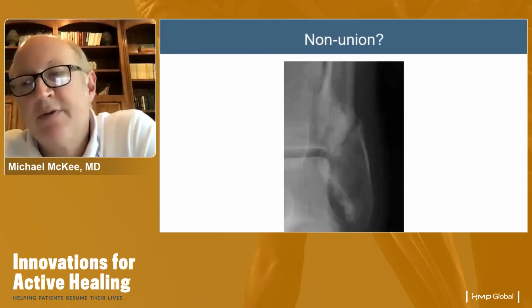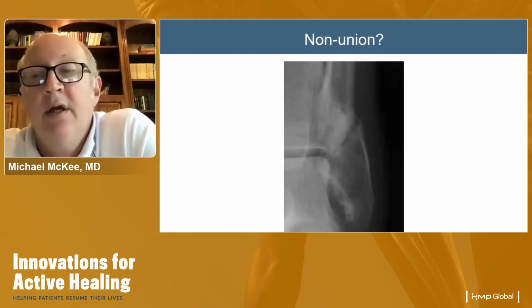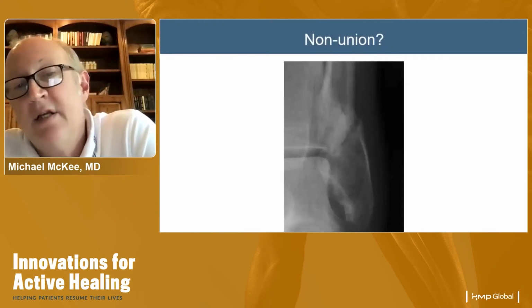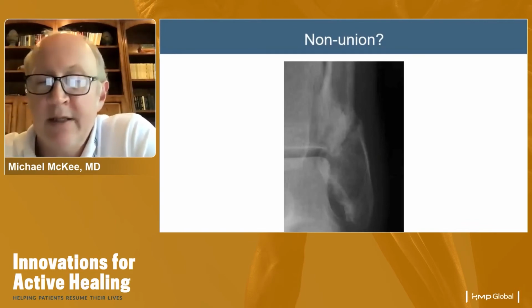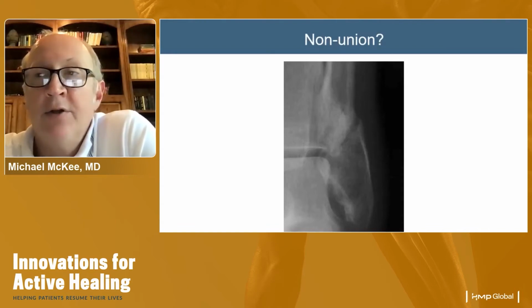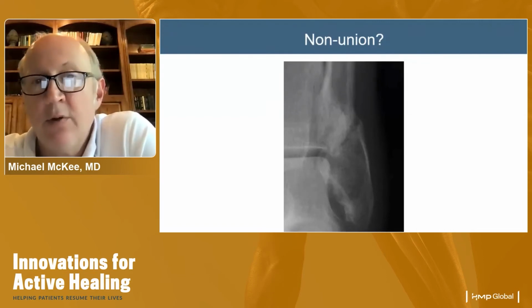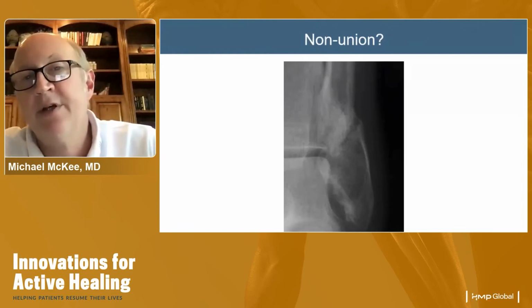You look at this x-ray, and this demonstrates some of the difficulties in telling, well, is this fracture united or not? Certainly looks like a pretty clear fracture line there, though there's some haziness, and it may just be that this particular radiograph doesn't catch that non-union, so to speak, at the right angle so you can see it clearly. And if you have non-union in one particular plane and your x-rays are taken in that plane, it can look much like this. And so in these situations, further advanced imaging is often appropriate.